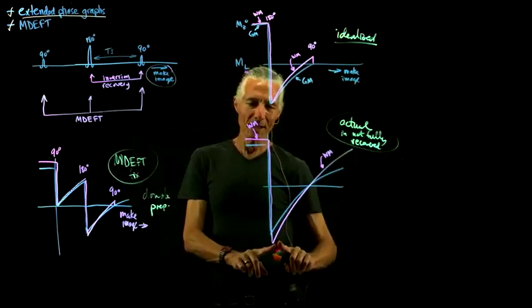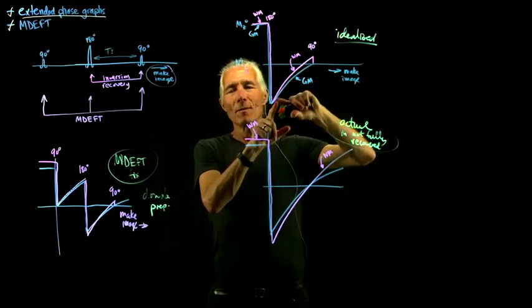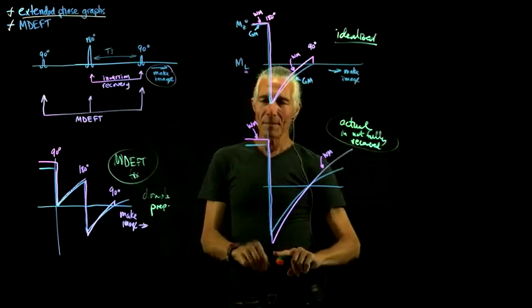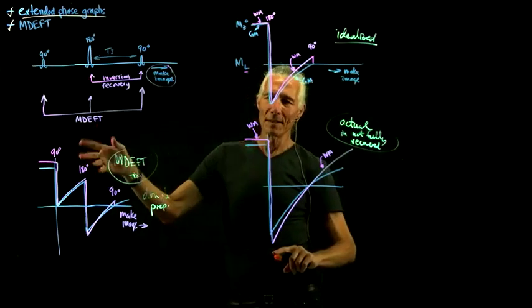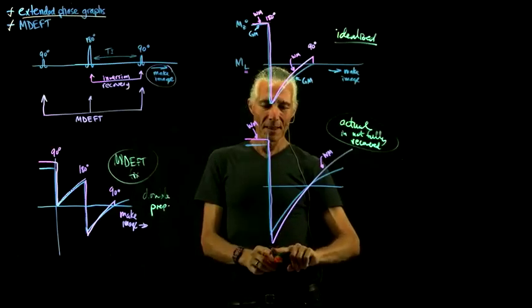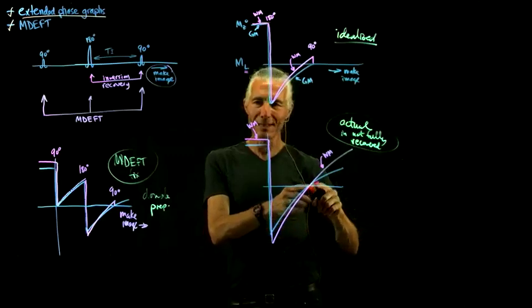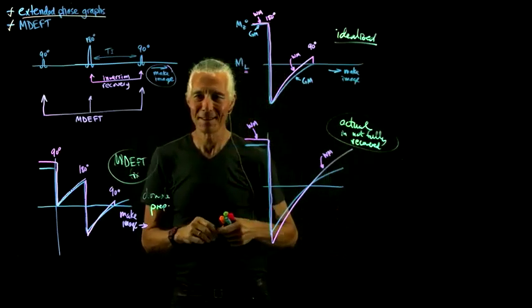So what we're trying to do here is, the white matter is recovering faster, and so we wait until the gray matter hits zero. And the problem here is the white matter is still recovering faster, but because they hadn't fully recovered from the previous pulse, you're going to start off with a signal for the white matter that's more negative. And so then as it recovers faster, it blots out the difference that we would hope to get when they pass zero. Yeah.